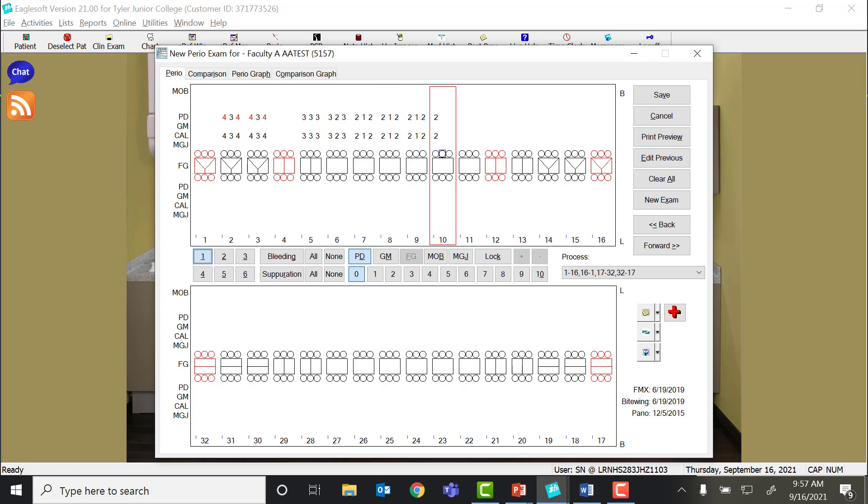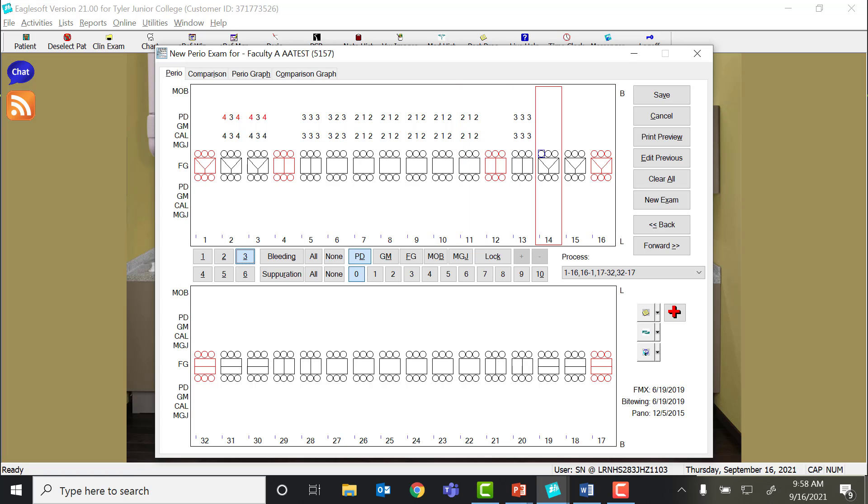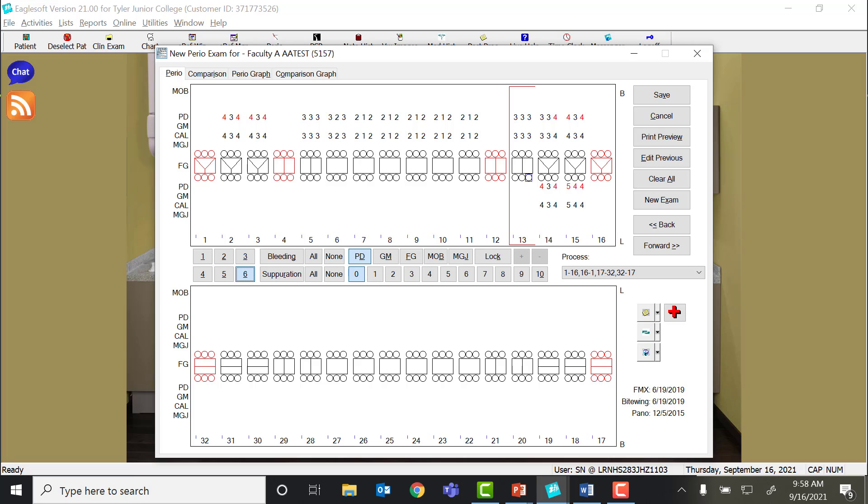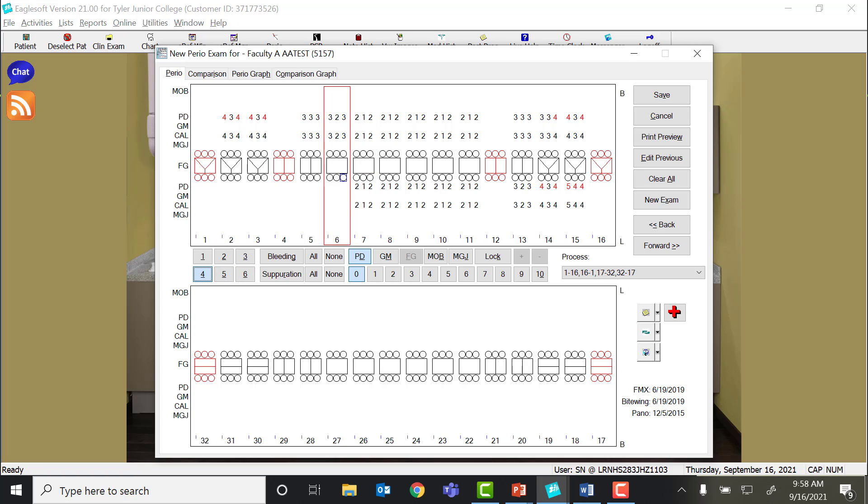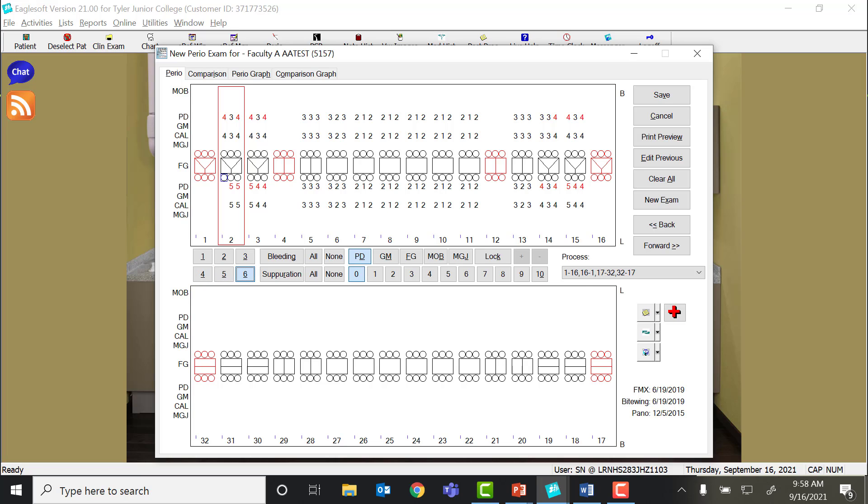I'm going to go all the way across the facial. Notice that it is skipping the teeth that I have taken out in Eaglesoft. Also notice that any number over 3 is red, and that's so it will bring your attention to those areas that have greater attachment loss, or maybe there's a little inflammation where the gingival margin is above the gum line. So this is how to type in just probe depths.